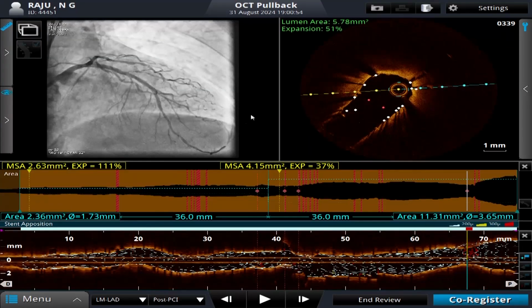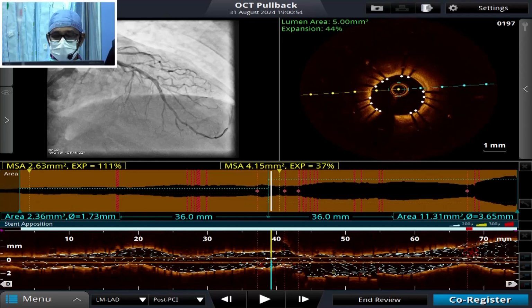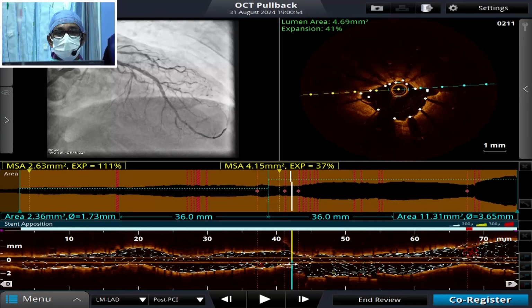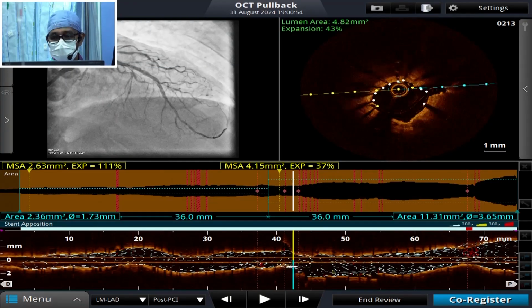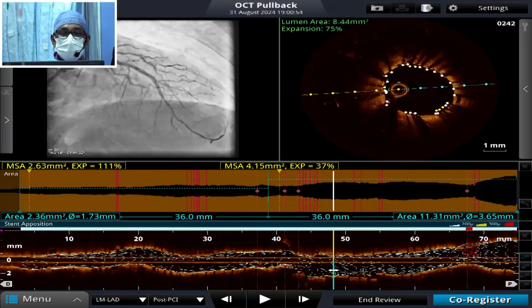Seems that overlapping portion, isn't it, sir? Yeah, that area. Yes, sir. This is the area where we had that underexpansion, 4.6. But as we go distally, again, it's almost 5, 4.9 only. At the area of the diagonal, that's the area where we have it around 4.5. Again, anything above 4, probably we can accept it at that particular area.